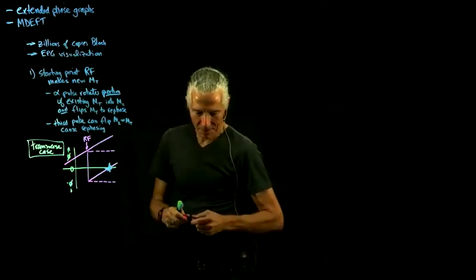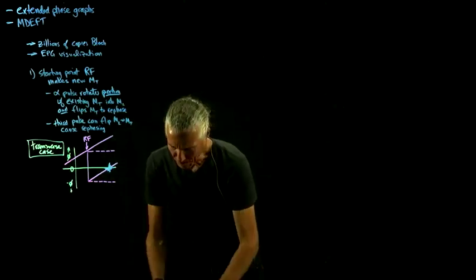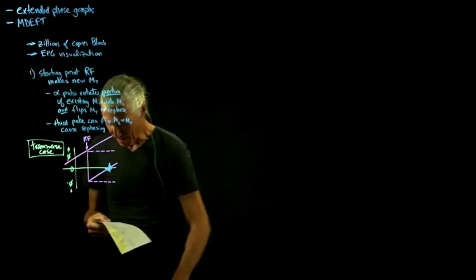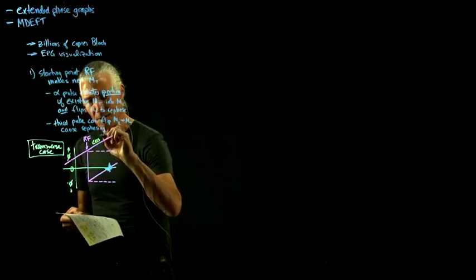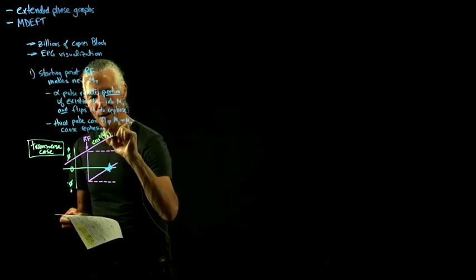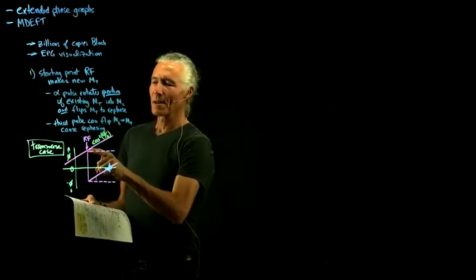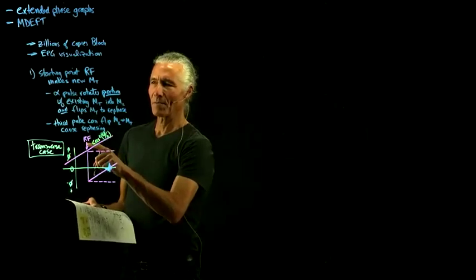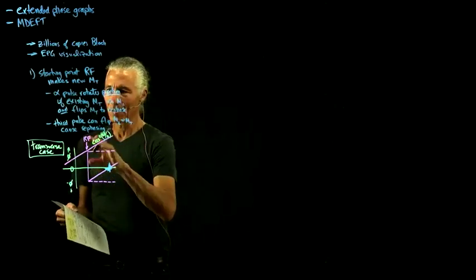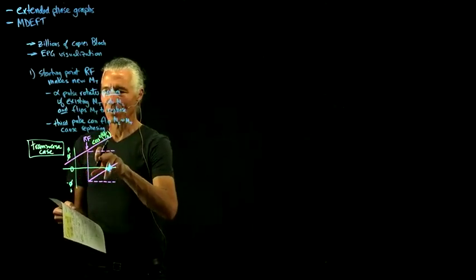And we can even say how much goes down each path. Boy, that's kind of small, isn't it? Okay, if we do some sines and cosines, we can say, if this is the phase angle, how strong the pathway is depending on what the flip angle is, because if you change the flip angle, it will vary how much you distribute to the 4 different branches.